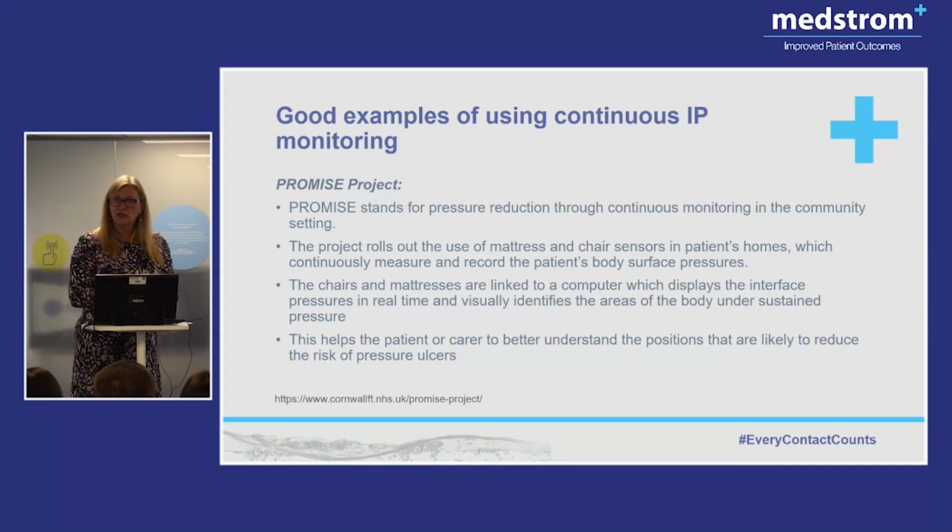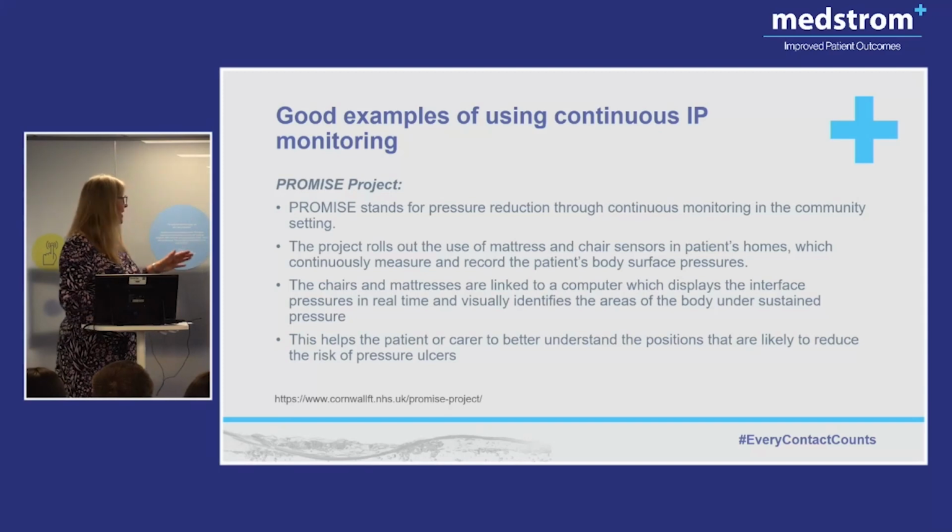So beyond saying, I need to tender for new equipment for my organisation, and I've got these 7 companies, I'm going to look at all the interface pressure profiles and make my decision on that. Not a wise decision, shall I say. That is not a good way to choose a mattress. These are things you might want to think about.